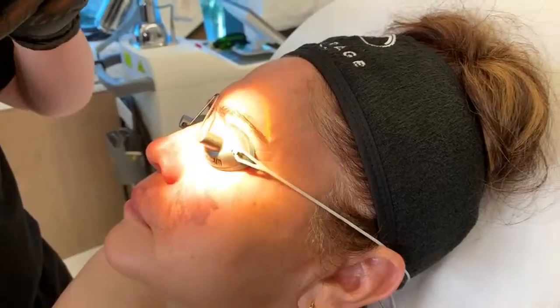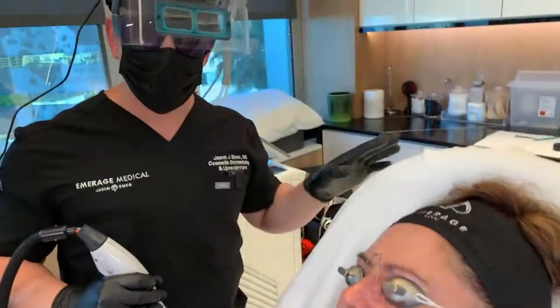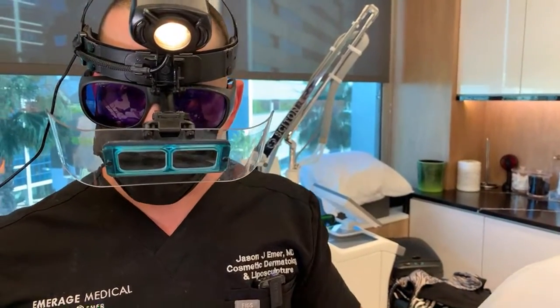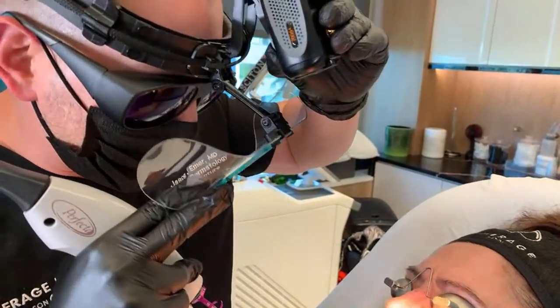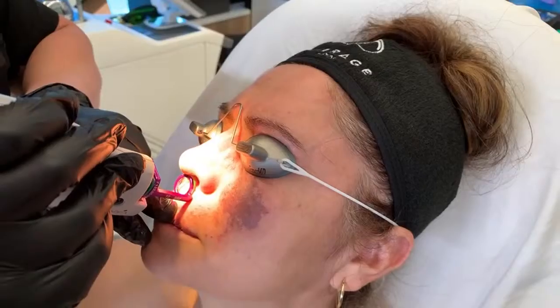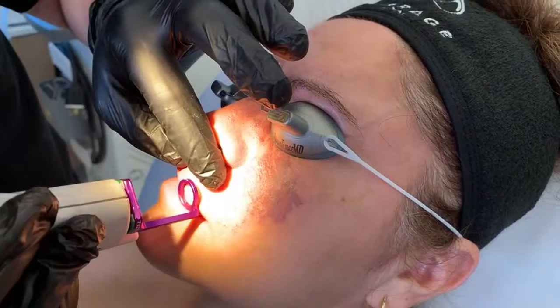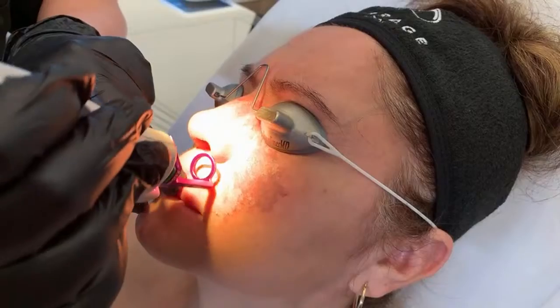I actually published a paper on a very similar birthmark years ago called lymphangioma circumscriptum — look it up online if you want to know what it is. I posted an article on using this V-beam treatment plus fraxel laser. You can see the birthmark extends all the way up, even onto her lip a little bit — sometimes it goes inside.